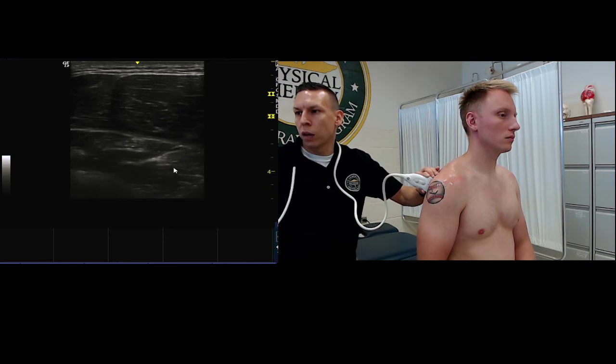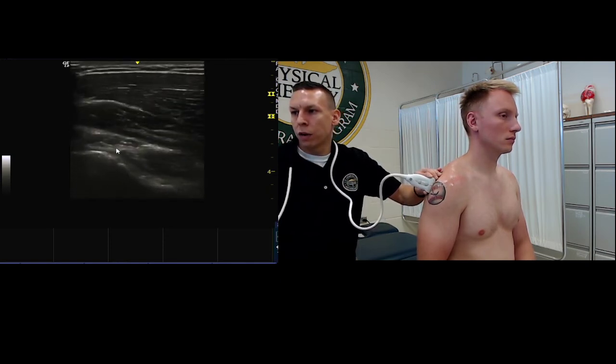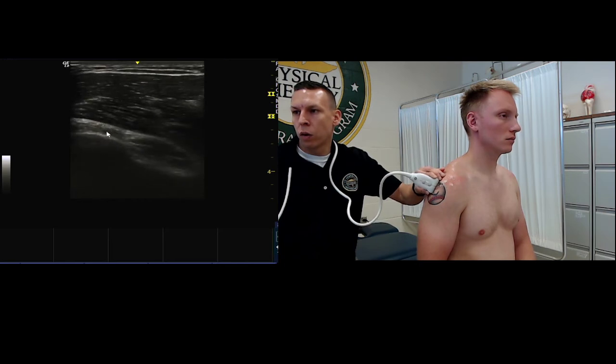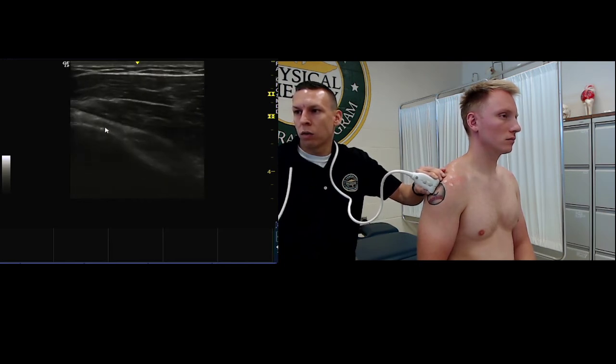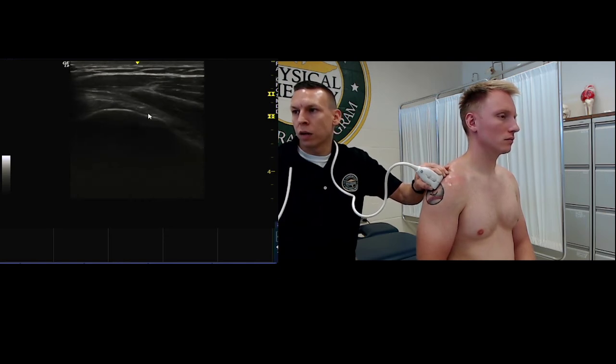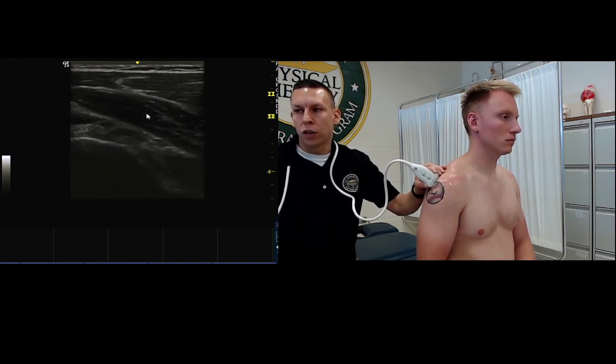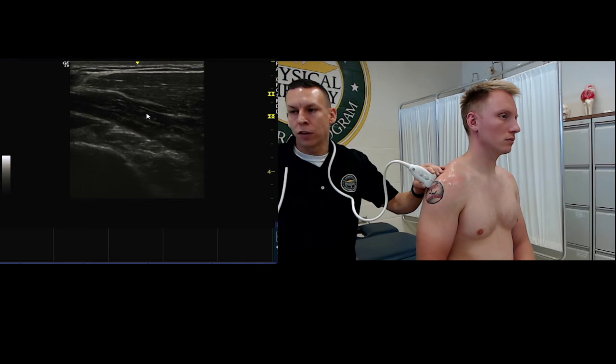Let me change my gain a little bit. This is the connective tissue for the teres minor, and we can follow that where it becomes a tendon as well. Right below, this is infraspinatus, this is teres minor, right there. So you can do that if you'd like to. I don't really find a lot of pathology in the teres minor, so don't spend a lot of time visualizing it.